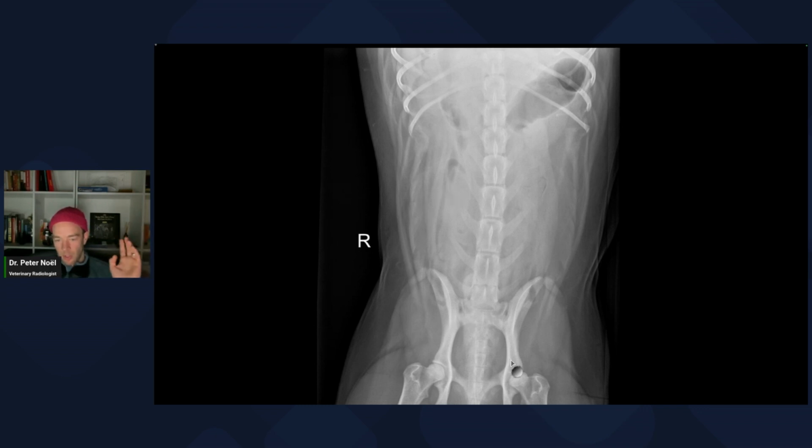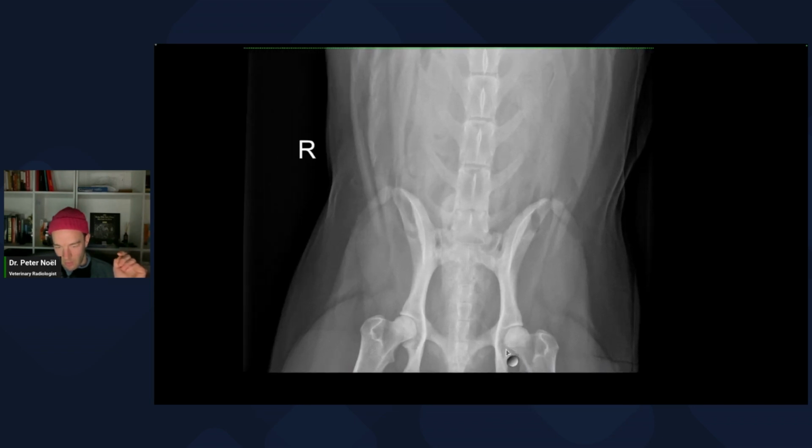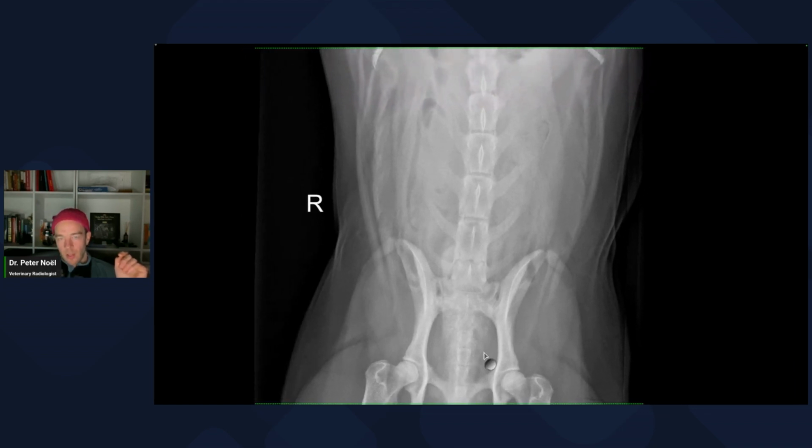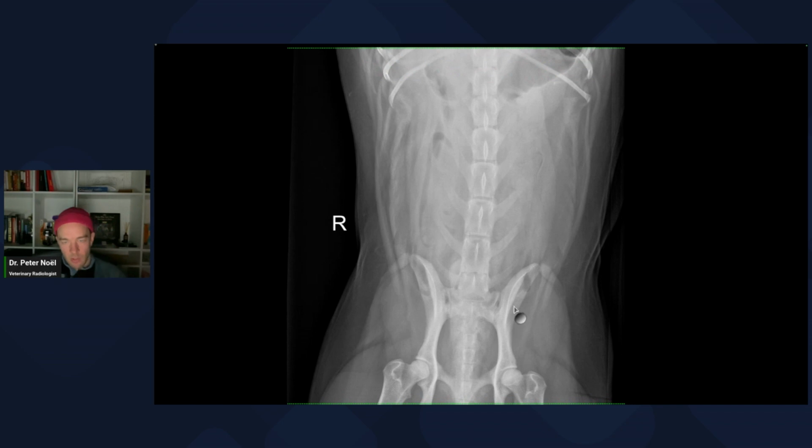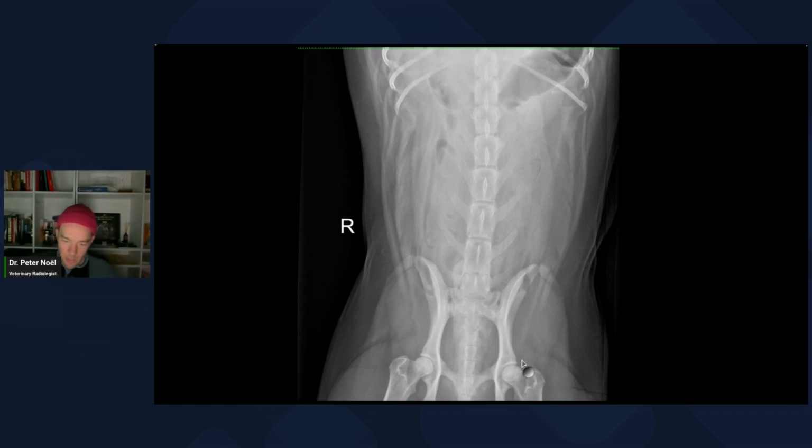Other things to kind of show you, these right here, these little thin areas of lucency right here that look like nothing. It's a circumferential femoral head osteophyte, this thing right here. And here's another one. Okay, that looks like nothing on histo. It's just a chunk of new bone formation where the joint capsule inserts on that femoral neck, and it should raise concern for some degree of laxity in the joints, though they otherwise look totally normal.